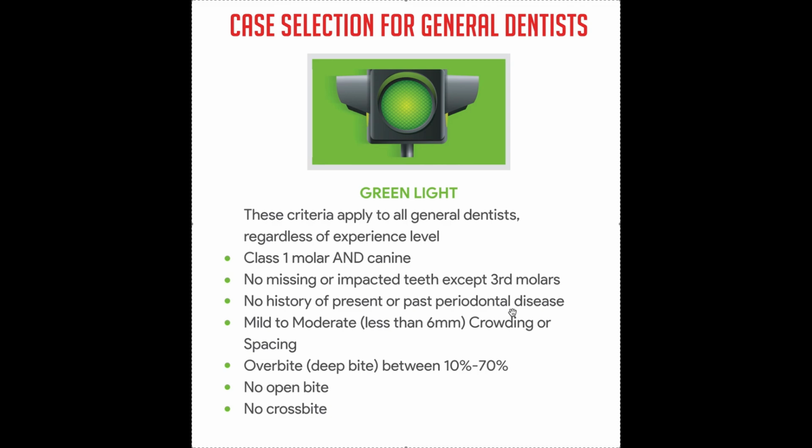I know this is harder because those of you who are general dentists, a lot of your practice is older. We're going to get there. Those are going to be more advanced. It just complicates things and makes it less predictable. So I'm trying to have you stick with super simple cases. And I realize with these restrictions, it's going to be a very small percentage.